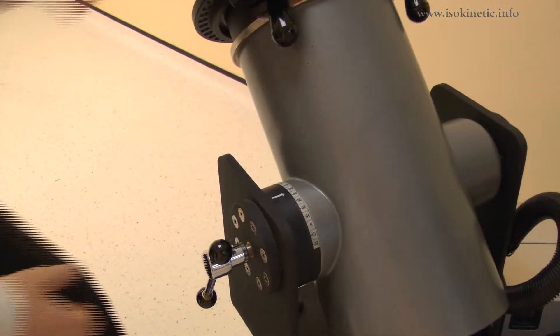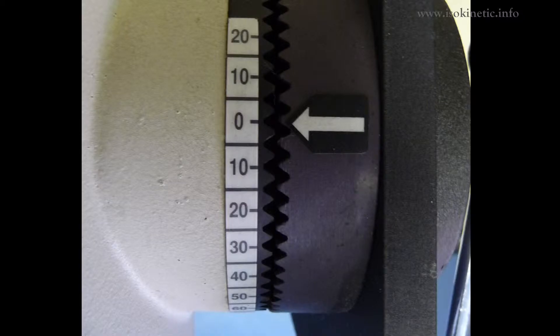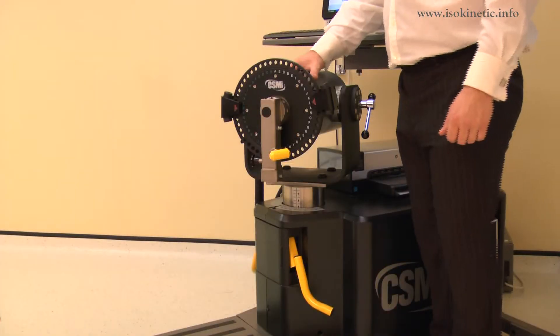Now set the dynamometer tilt. Release the locking handle then change. Adjust the tilt angle to 0 degrees. Lock by tightening the handle. The dynamometer height and rotation are adjusted together.